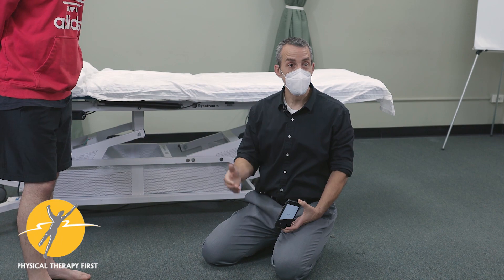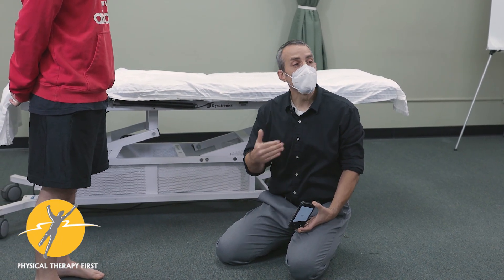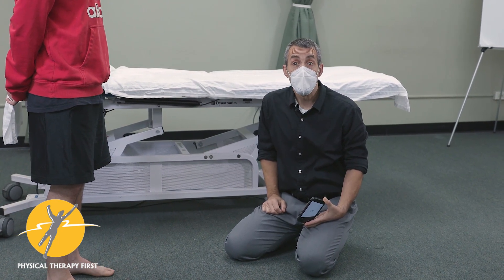You can tell the patient: 'You're about 10 degrees restricted — no wonder you're having some discomfort. We did the mobilization and improved it by 10 degrees. Now it's your job to keep it mobile, and here are the strategies we're going to use for that.' It's very useful to give the patient that feedback.